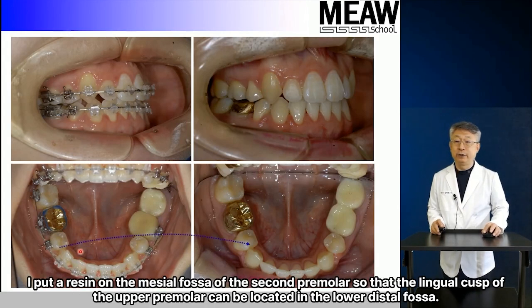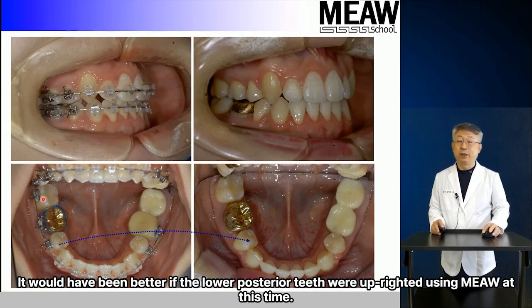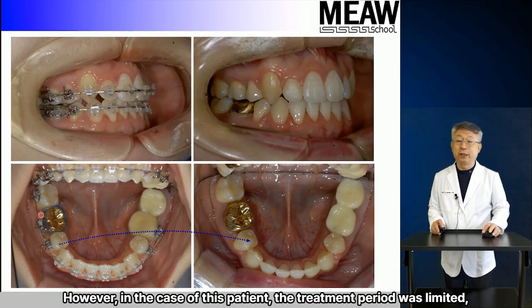I put a resin on the mesial fossa of the second premolar so that the lingual cusp of the upper premolar can be located in the lower distal fossa. The posteriorly positioned mandible moved slightly anteriorly, resulting in a matched midline. It would have been better if the lower posterior teeth were uprighted using MEAW at this time. However, in the case of this patient, the treatment period was limited.